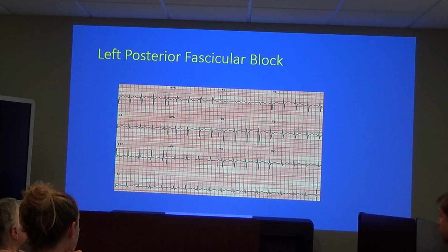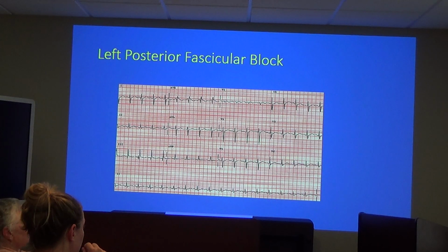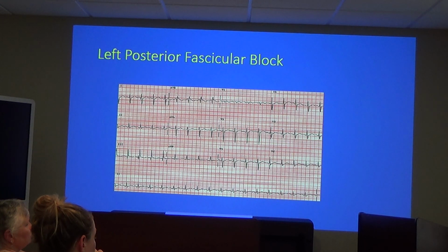So this is otherwise not interesting. Again, the QRS is not particularly wide, maybe a tiny bit. It may be slightly over 100, but it won't be 120. If it's over 120, you've got some other significant conduction delay that's affected a whole ventricle, one way or another. The QRS is very short, not tall on V1. Does that have any significance? Not particularly. It's just the slight variation in which direction the axis is in relation to that lead.